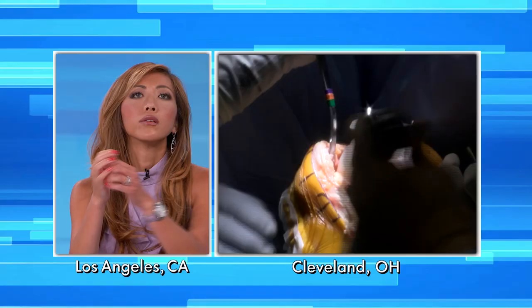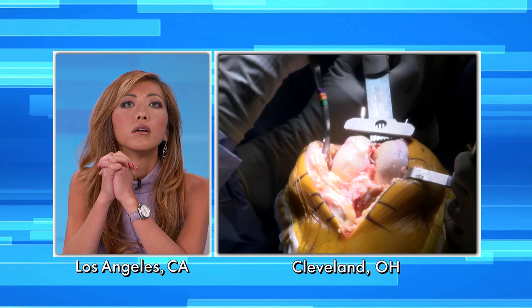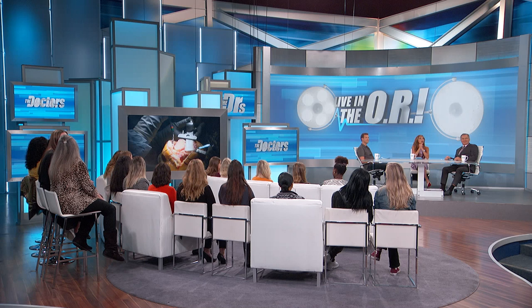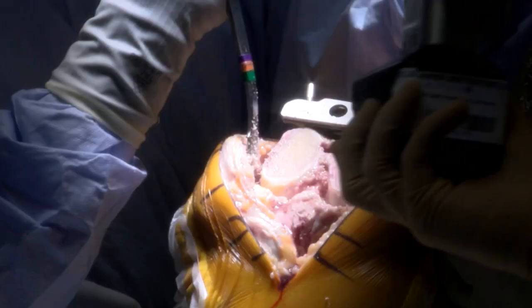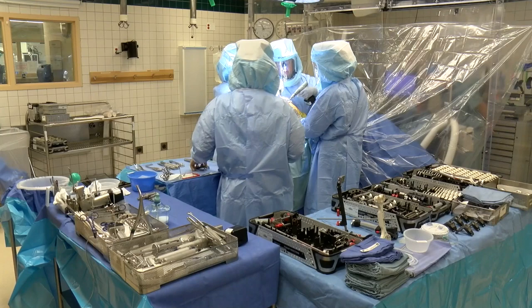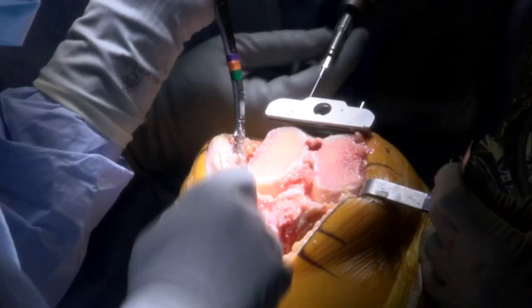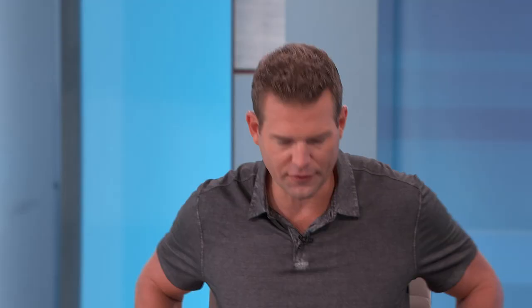Now we're getting ready — we're going to cut the end of her femur here, and it removes about nine millimeters of bone. When everybody thinks about knee replacement, a common question I get in clinic is how much of their knee we're going to take out. It's not really like we remove the knee — you can really think of it as resurfacing the ends of the bone where the cartilage is worn out.